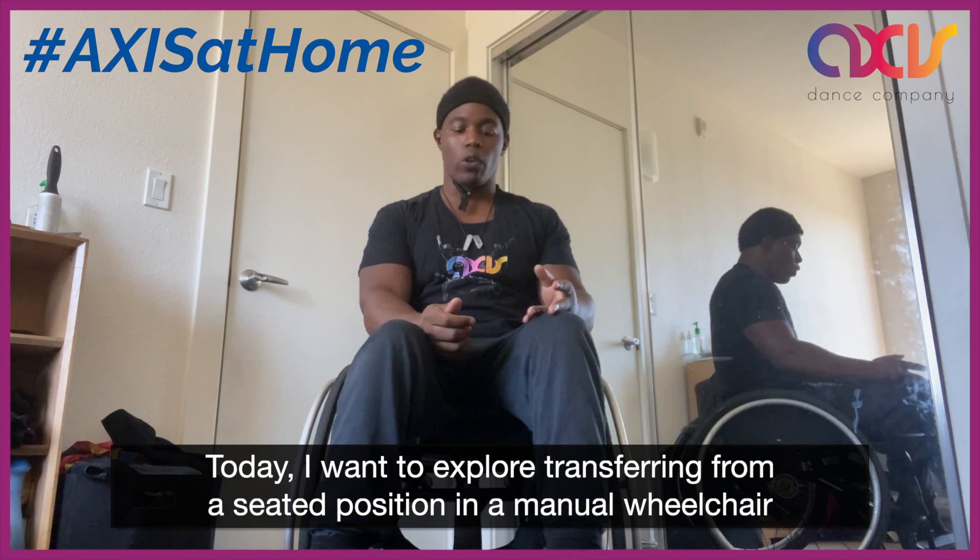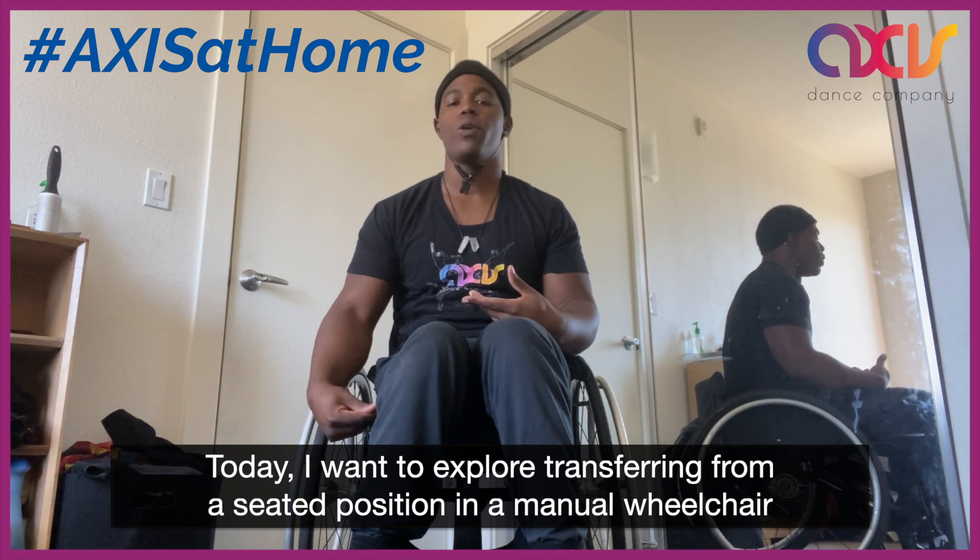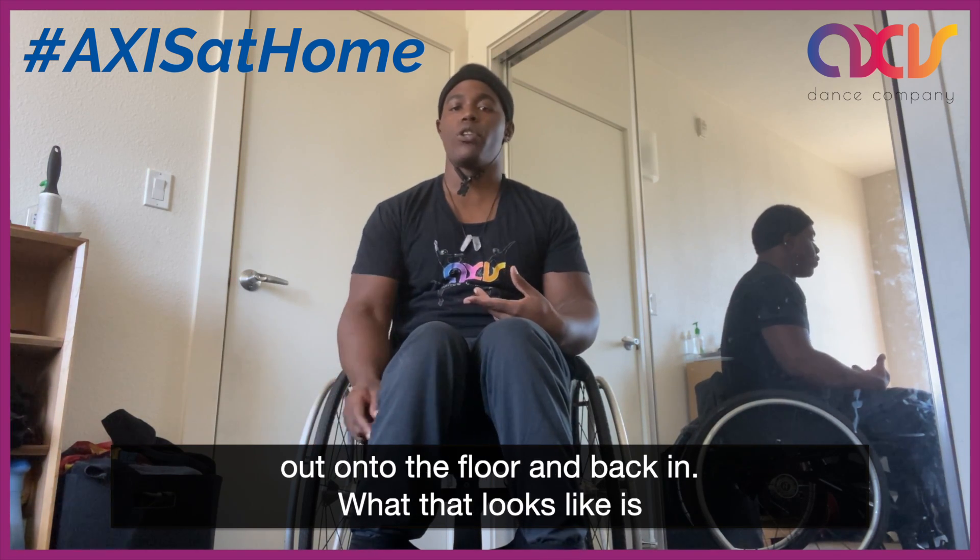Today I want to explore transferring from a seated position in a manual wheelchair out onto the floor and back in.